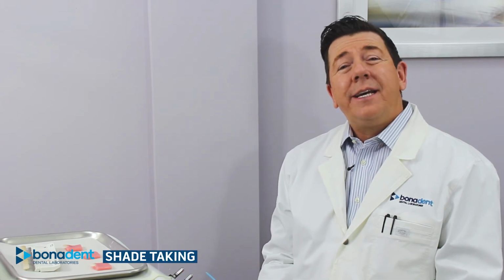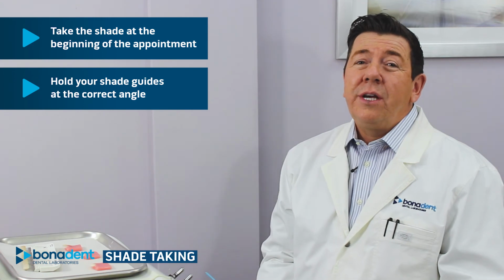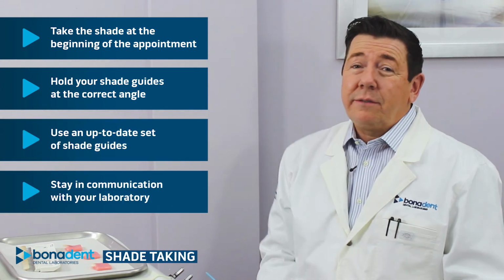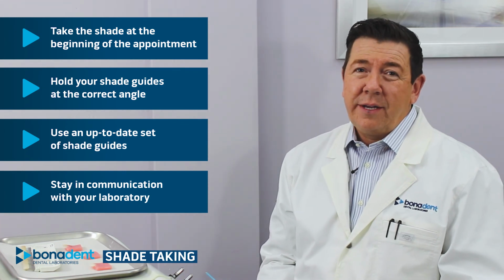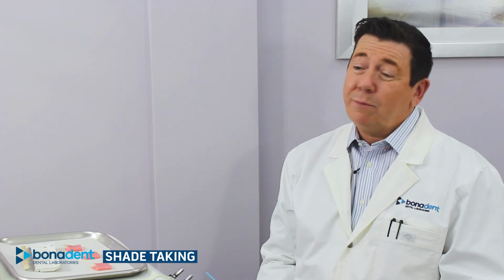So once again, take your shade at the beginning of the appointment, have the correct angles, using that appropriate shade guide, and always stay in communication with your laboratory, and we'll get you to that beautiful aesthetic result.